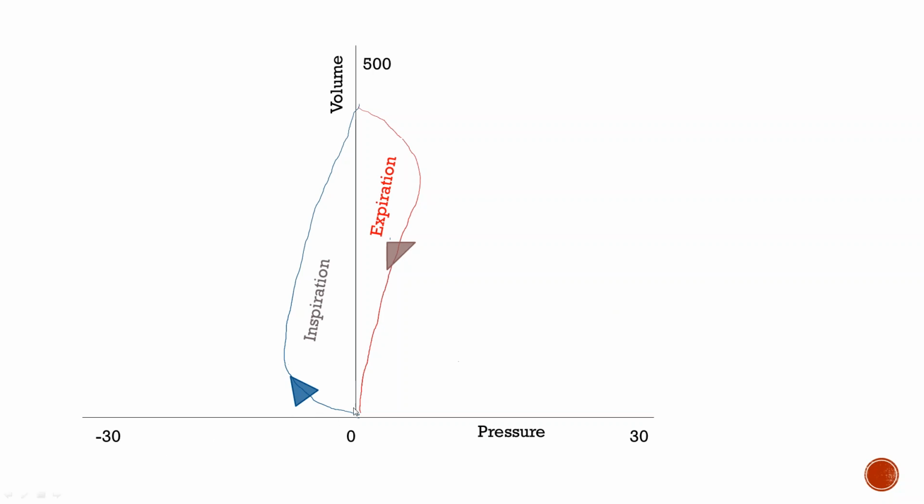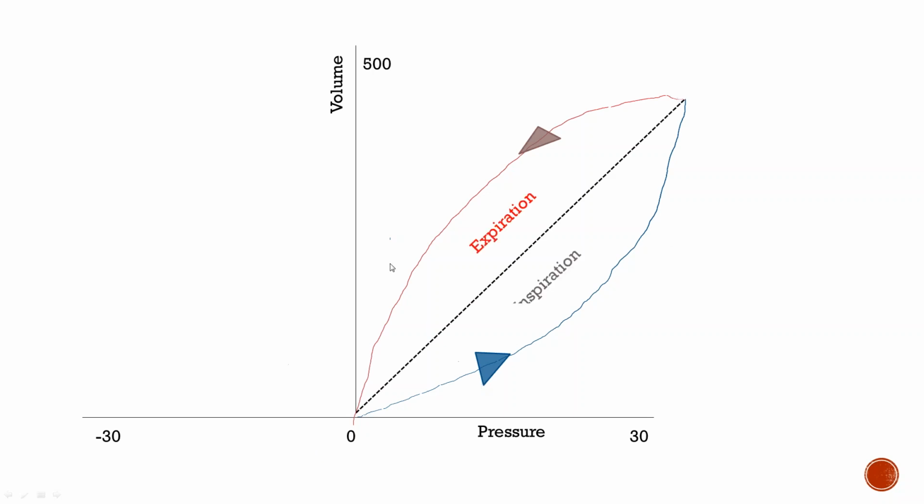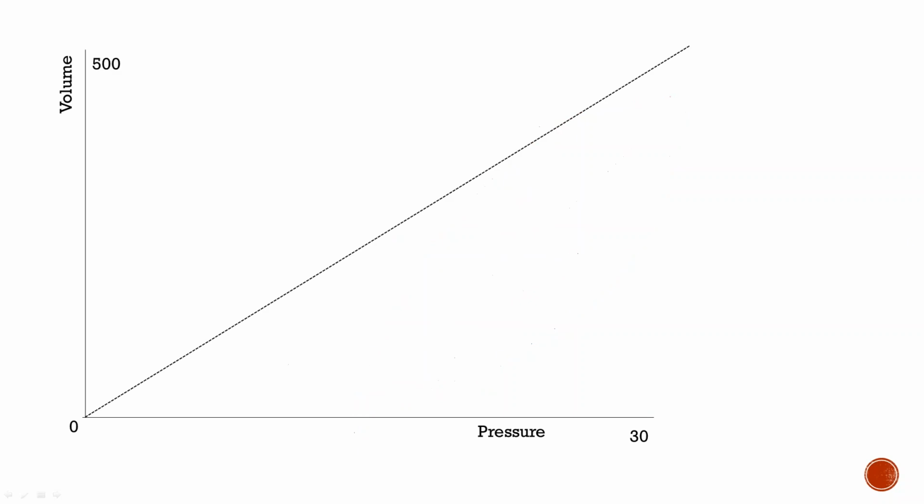So the curve will go like this on the ventilator loop. So let's look at the next one. This would be a passive ventilator breath, the one we're more familiar with, which we see on the ventilator most of the time, inspiratory and then expiratory breath. Okay, what's coming next?